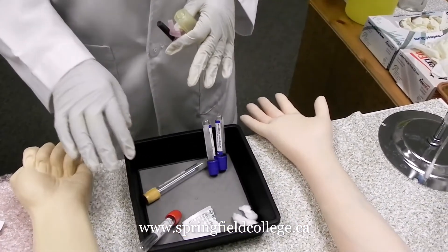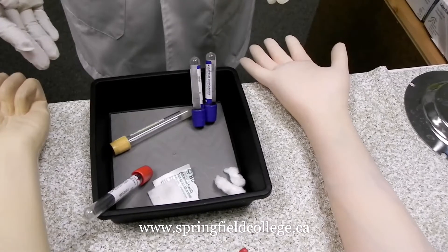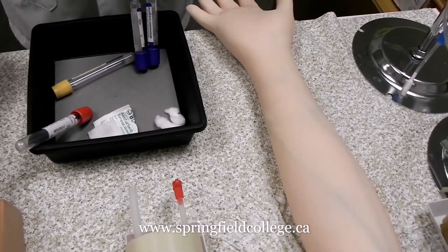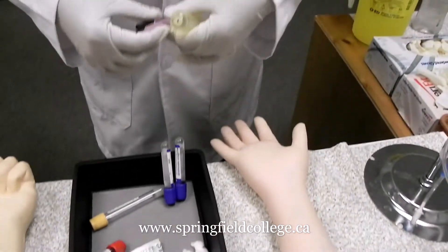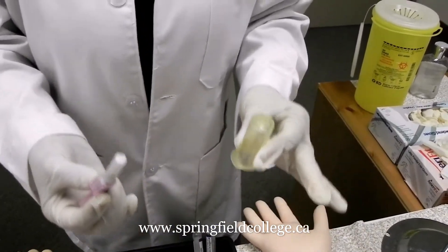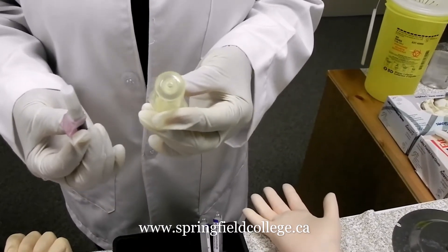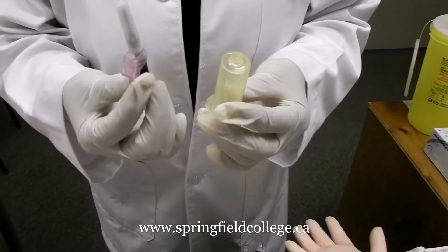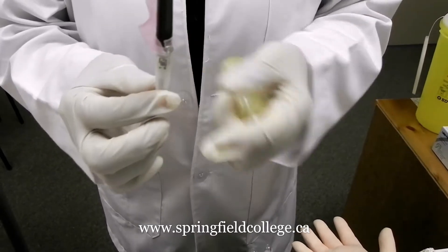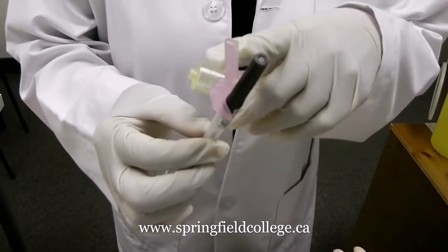Depending upon the tubes you are going to collect, you can have a multiple draw — you may be having three, four, or five tubes — or a single draw. Now I take my tube holder and my needle. Here we see this is a 22-gauge needle. I prefer a 22-gauge needle with a safety feature, and this is my tube holder.